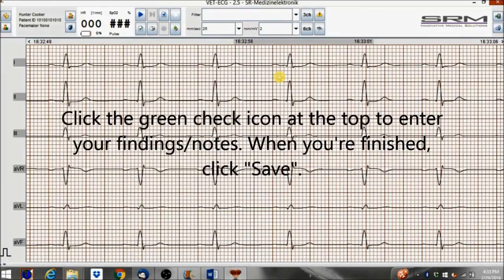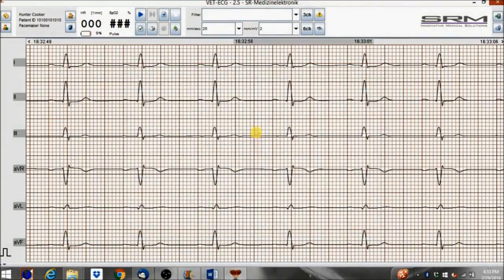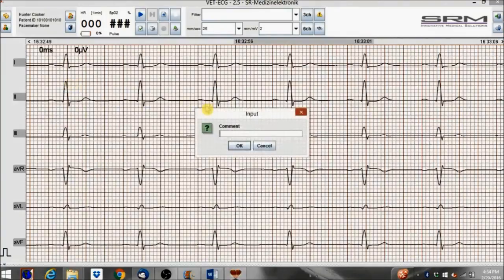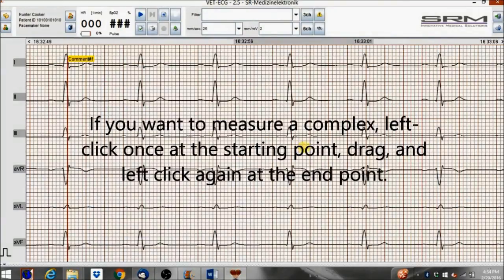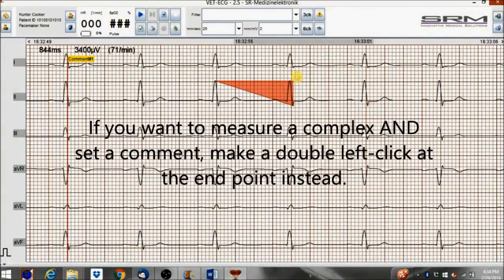Click the green check icon at the top to enter your findings and notes. When you're finished, click Save. Double-click inside the recording to set a marker and or a comment. If you want to measure a complex, left-click once at the starting point, drag and left-click again at the end point. If you want to measure a complex and set a comment, make a double left-click at the end point instead.